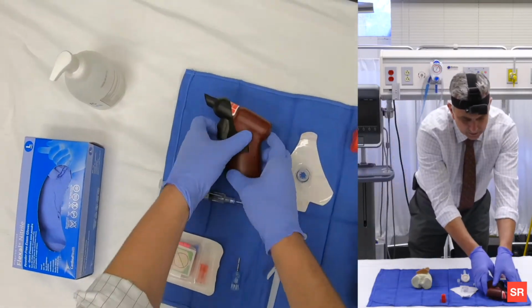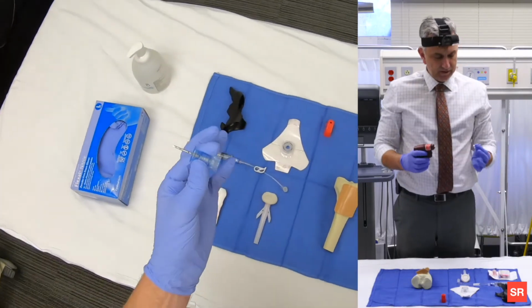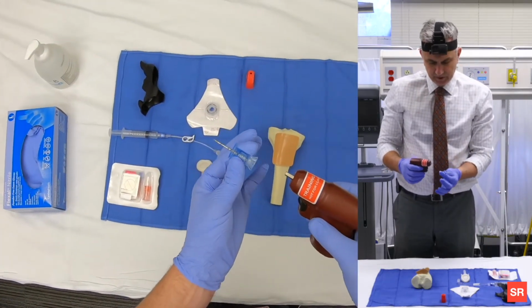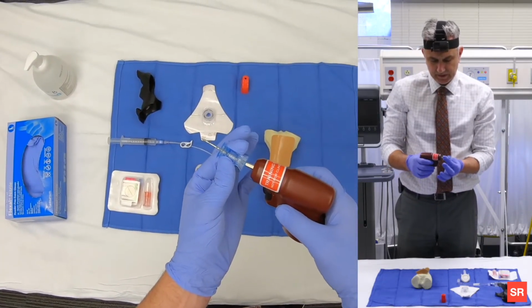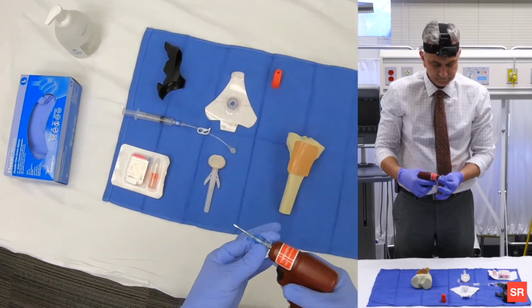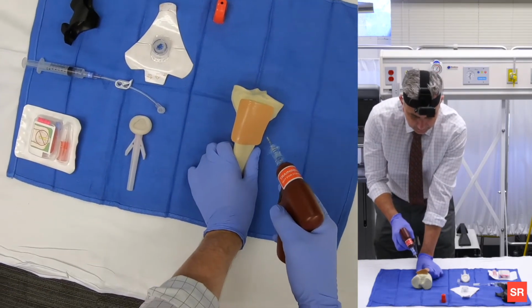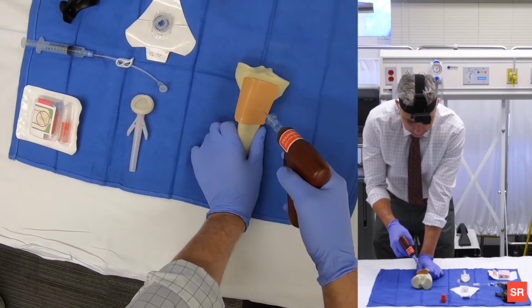I am now going to set up my drill. Again here, I'm using the 25 millimeter introducer needle for demonstration purposes. I'm going to attach it. I hear it click, so I know it's engaged.